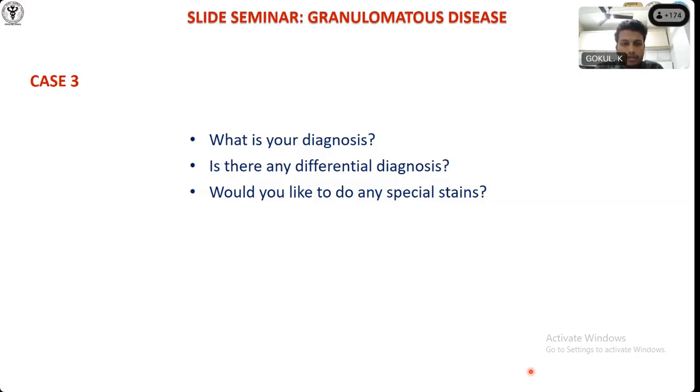Do you see reticulin-rich granulomas in tuberculosis? You can see, yes, you can. So these are just additional features. Why I'm highlighting this is that in granulomatous disease, especially lung, although you will see granuloma every day, the classical cases we describe or you study in the book are just the tip of an iceberg. Most of the time you will not see a classical case of tuberculosis or a classical case of sarcoidosis.